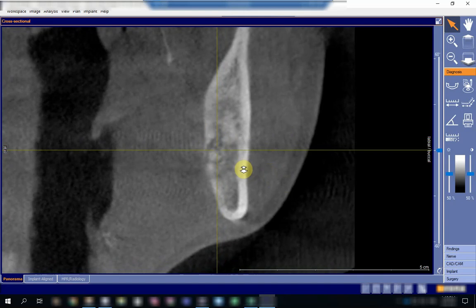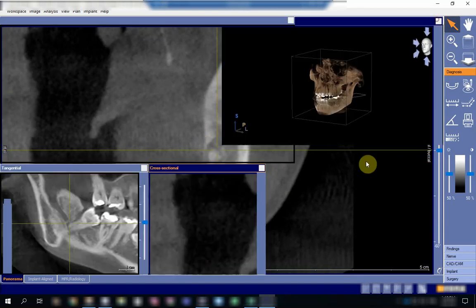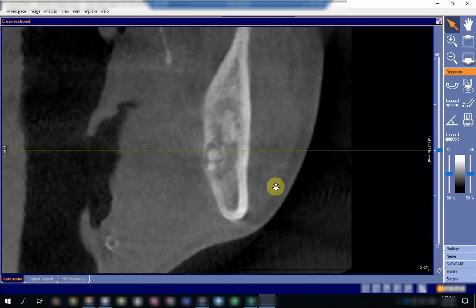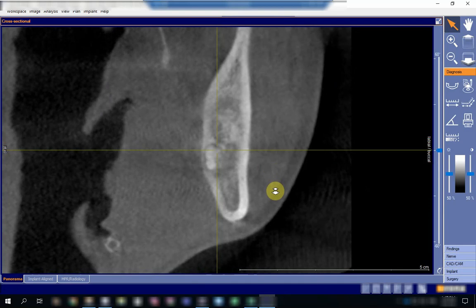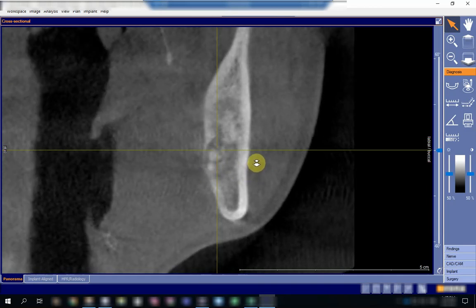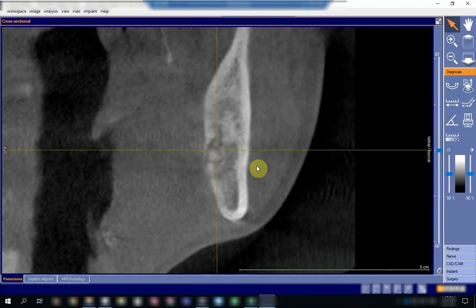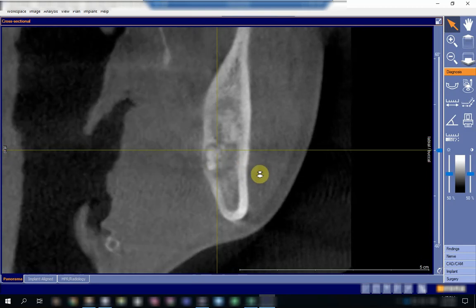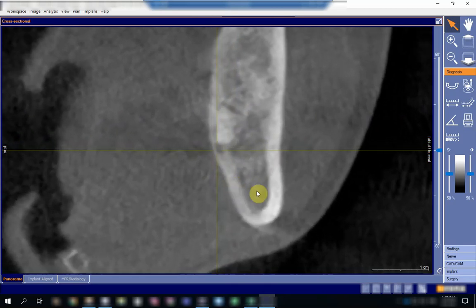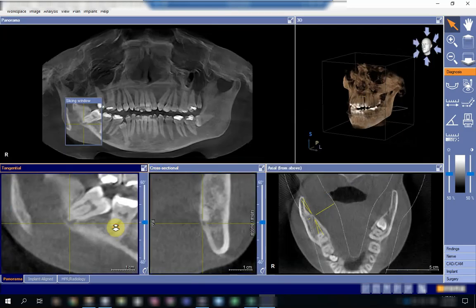The canal is passing in a lingual direction to the root—exactly, it is passing lingual to the distal root of the partially impacted tooth. The canal passes below and very close to the apex of the distal root, then goes in a lingual direction and passes just underneath the mesial root as well.